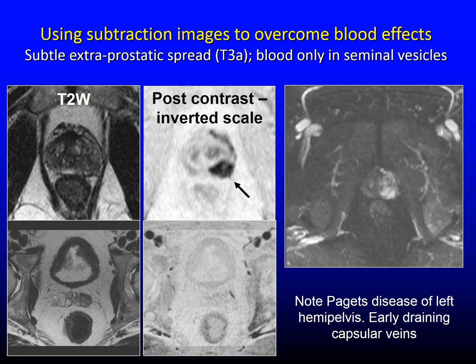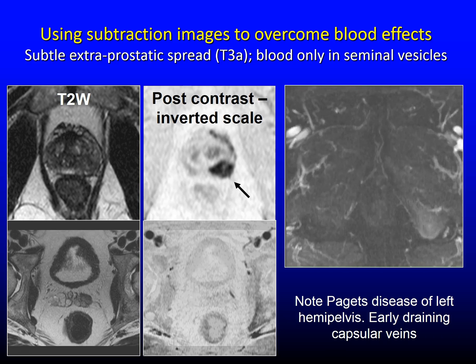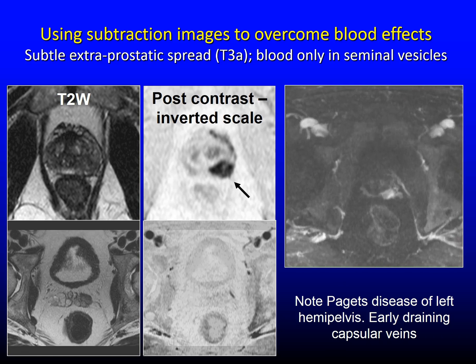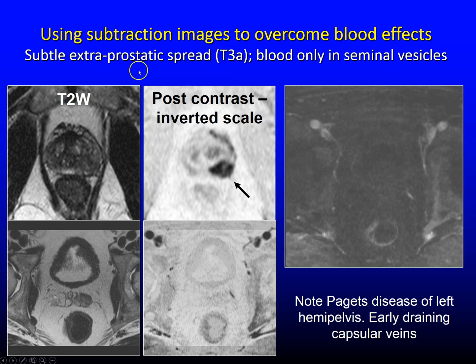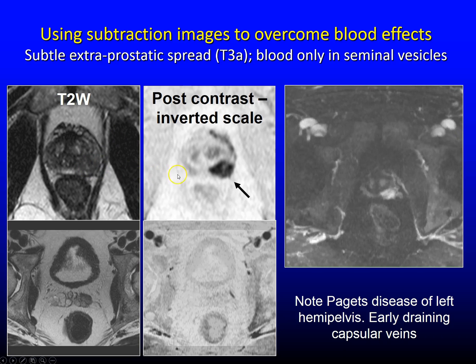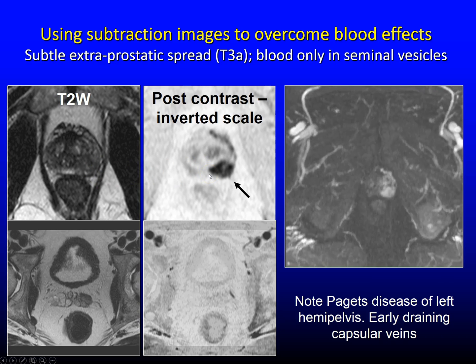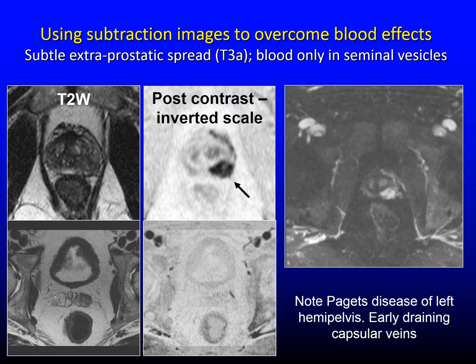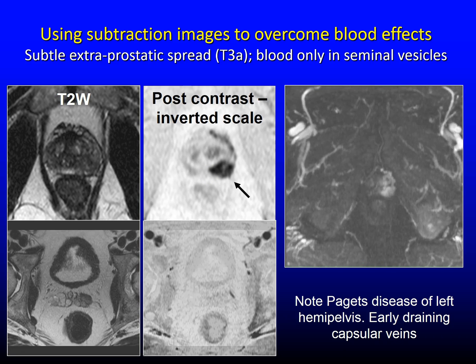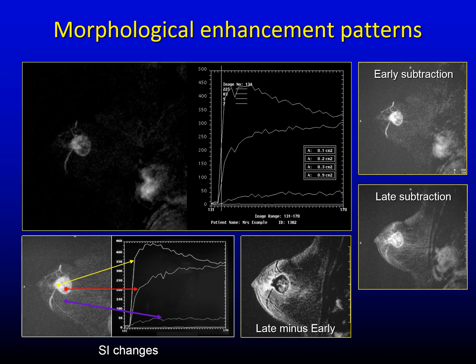And this is a type of lesion that will be classified as positive. In a patient with prostate cancer, we can see that we are able to pull out on a dynamic enhanced study the presence of a lesion not easily depicted on the T2 scan, but we can clearly see it on the DCE-MRI images. So this would be positive in the new PI-RADS version 2 system.